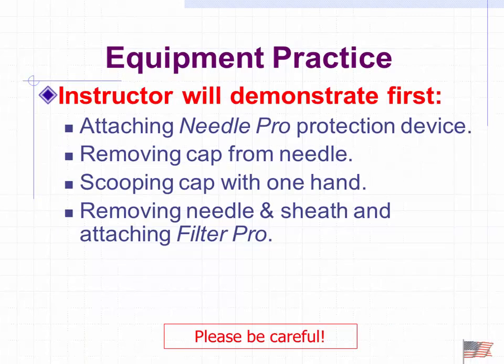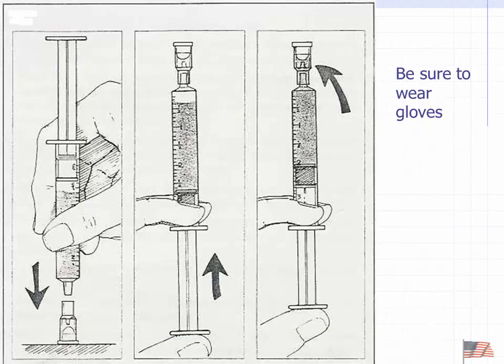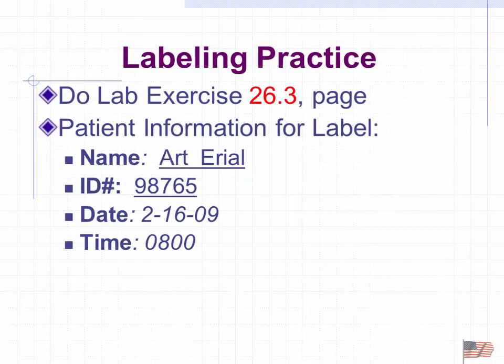After we collect it, we want to affix a label to it. Many places have ones that are generated by the computer, so you just put it on there. But we should have some pertinent information so we know which patient this was drawn from.